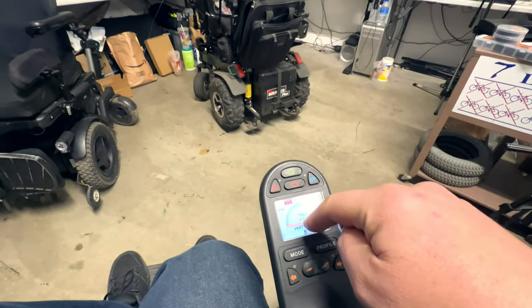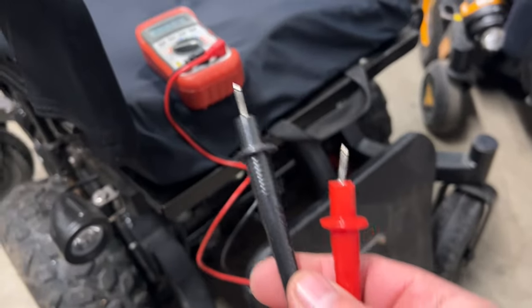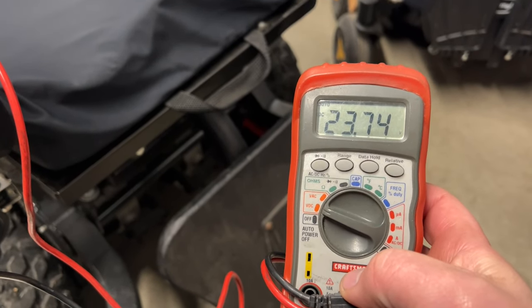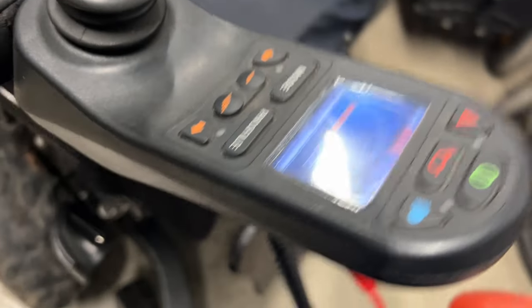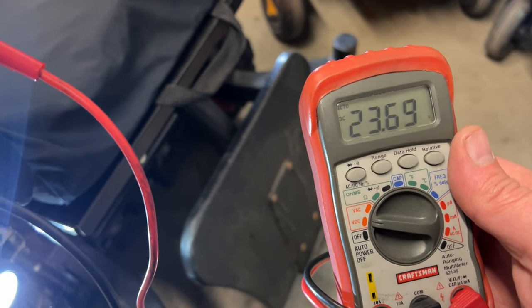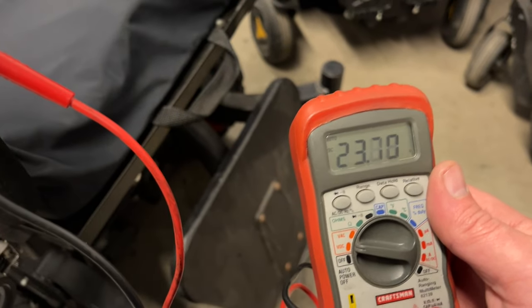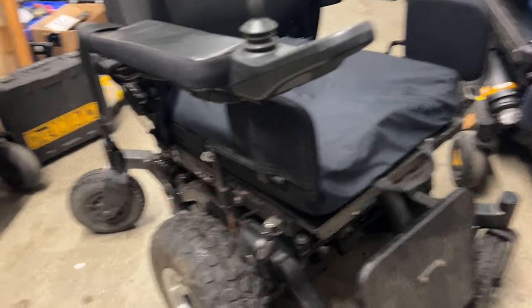I'm going to hop back into the F3 and stick a voltmeter in here to see what our voltage is. We have a voltmeter set to DC volts — the probes on this one are pretty bent, which actually makes it easier to measure voltage on a power chair. We are at 23.74 volts, which lines up with what the gauge says. We got one yellow bar back. Let's turn on the lights and see what the voltage drop is — that's about a 1.2 amp load for all the lights. So yeah, they are getting kind of low.